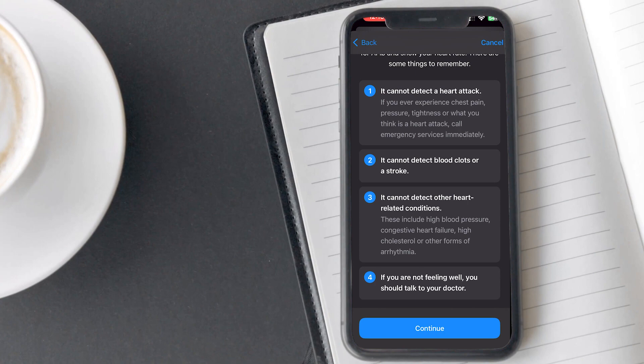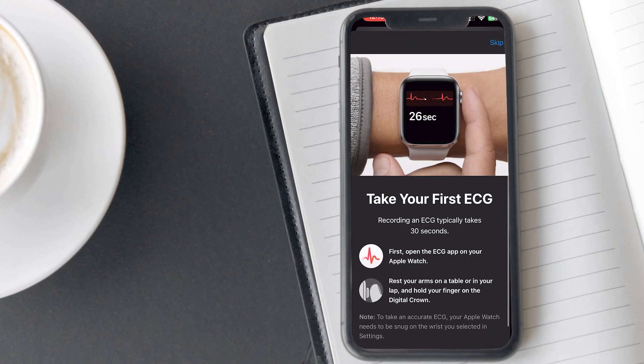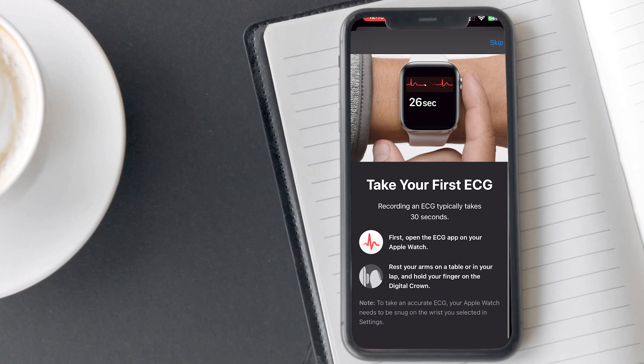Tap on continue to learn how to take your first ECG test. Recording an ECG takes approximately 30 seconds. On the screen, you will be instructed to open the ECG app, rest your arm on the table, and touch the digital crown button with your finger. For accurate ECG results, the Apple Watch needs to be snug on the wrist that you selected in settings.